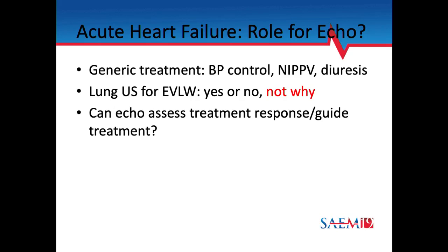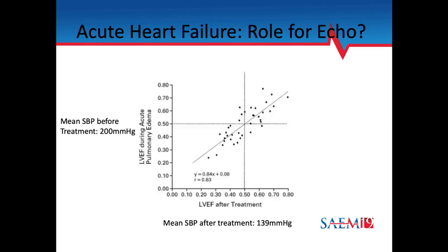We're going to see patients when they arrive. We're going to get an echo. We're going to start to treat them. We're going to get a second echo, and we're going to see how they've progressed, and we're going to use that longitudinal information to decide what we're going to do next.